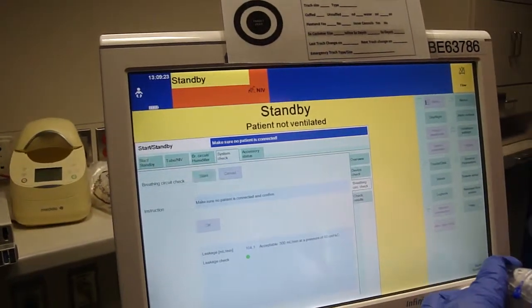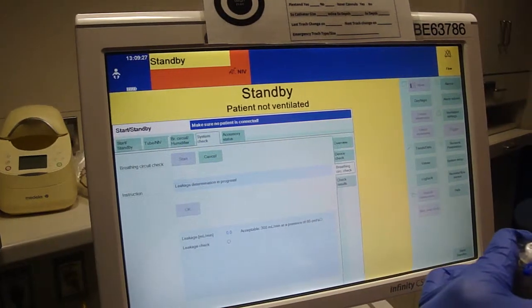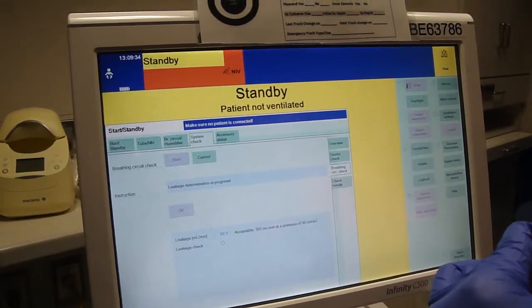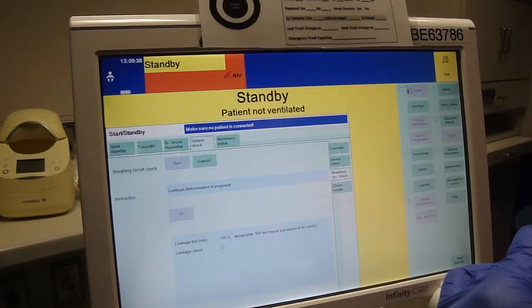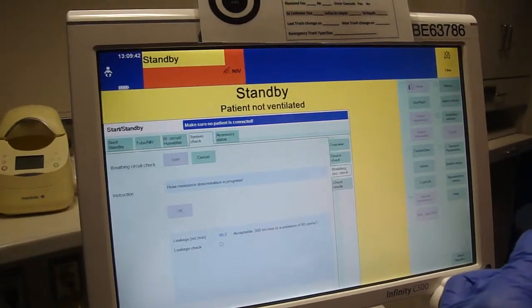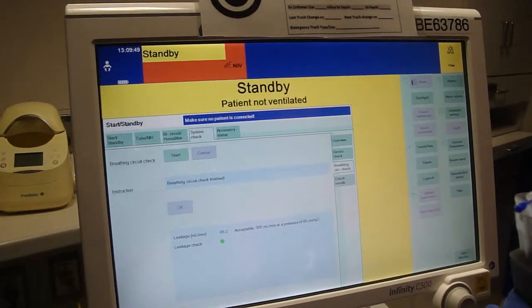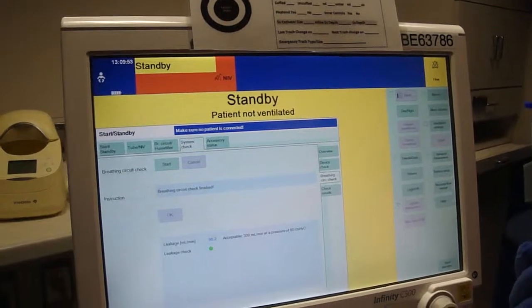Hit Start and confirm. The machine will then perform the leak test. Leak check is complete — we can now place the device on the patient.